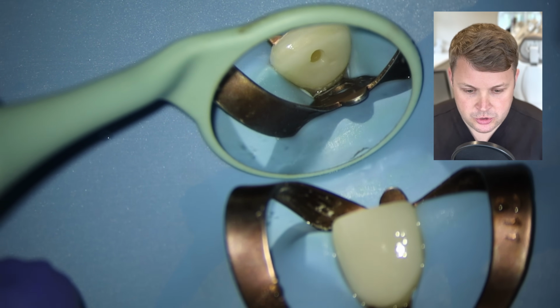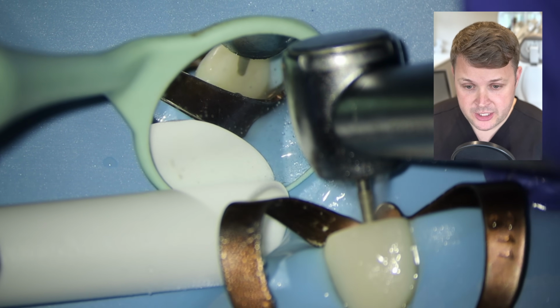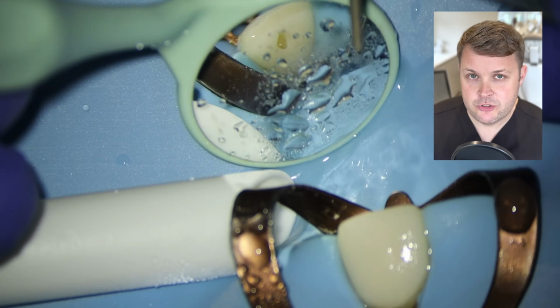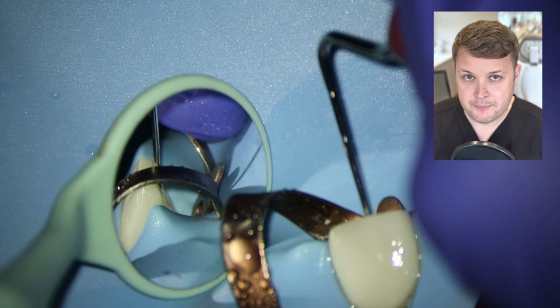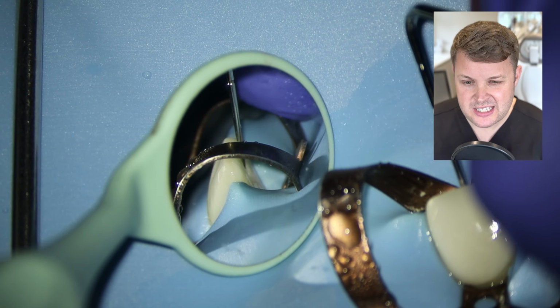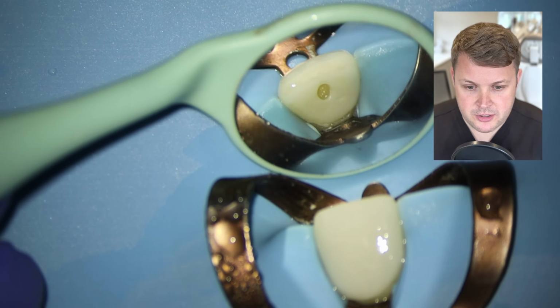So having adjusted it, I'm going to go back in with that, being mindful of my angulation of my burr, being a bit more careful, and then as I drill into this tooth, what I can see now is that I'm placing this Mach 2 plugger to the bur where I am drilling, and we can see that it's in the correct angulation. It's going down the long axis of the tooth essentially.